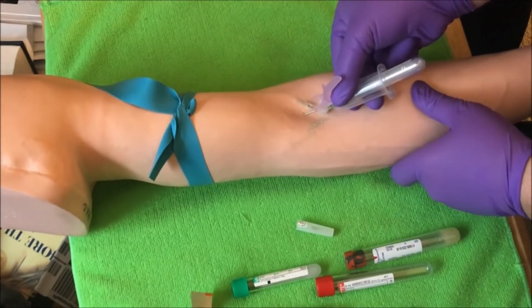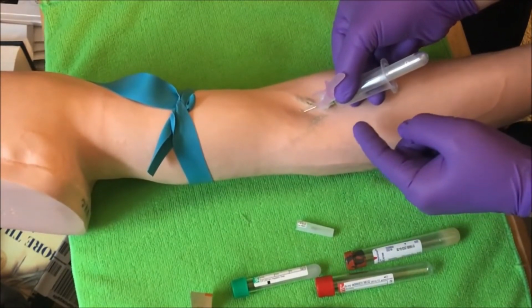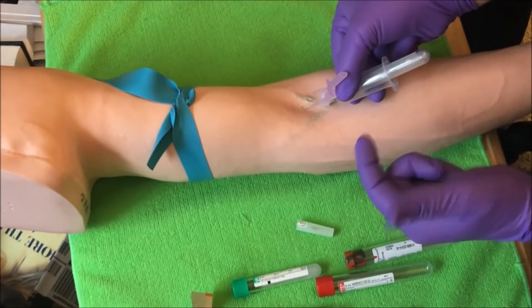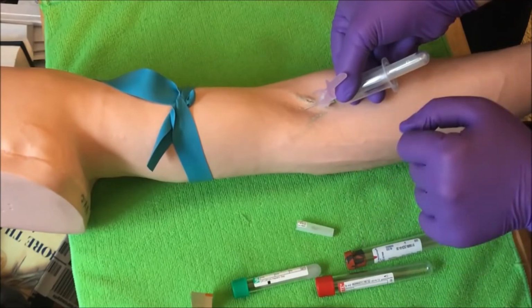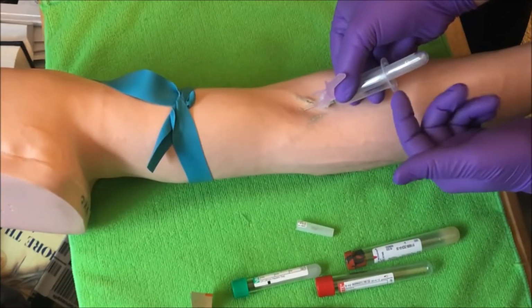I could only go a little deeper or pull back. If I get no blood flow on either pushing or pulling back or even retracting a little bit to help stabilize the vein, then I've missed the vein altogether and I need to start over. Once I get blood flow, then what I do is I'm going to remove my tube and get another tube. Again, no fishing.